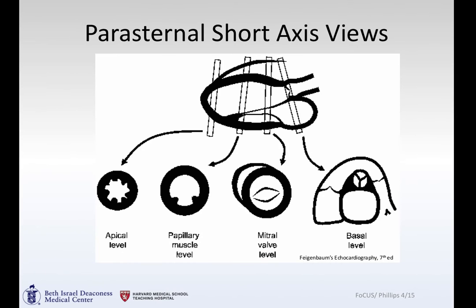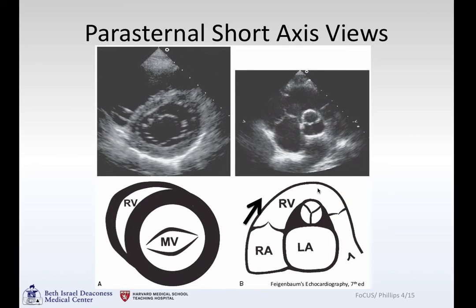When you're in the parasternal short axis, you can tip the probe to get apical views, views along the papillary muscle, mitral valve views, and then the coup de grâce basal-level view where you can see the tricuspid valve, pulmonic valve, and aortic valve, along with the right atrium, pulmonary arteries, and right ventricular outflow tract. Here are some examples of each.